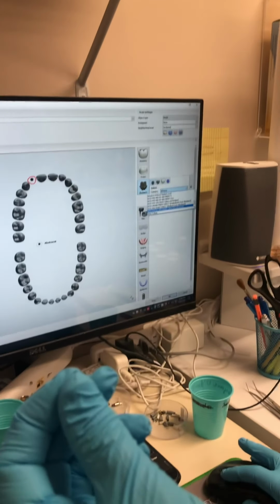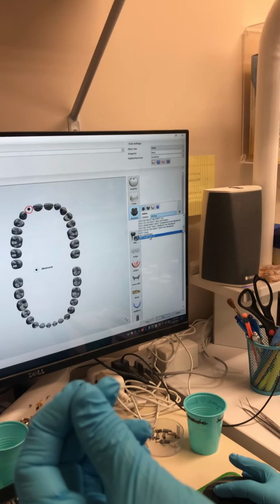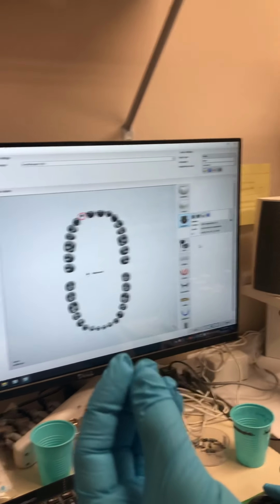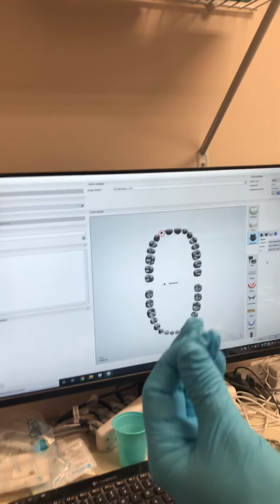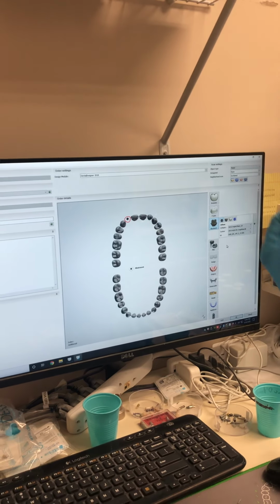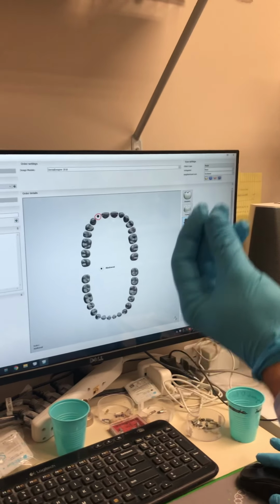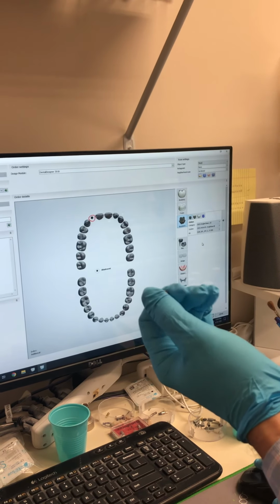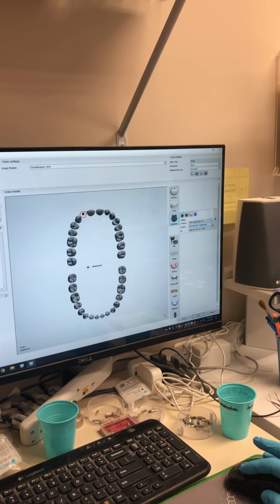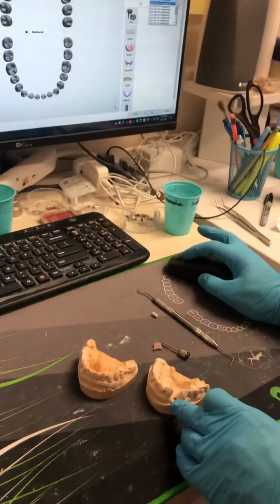DES, which is an angled abutment for US, click on it. All this information is given to you by the company. Any company, Nobel Biocare, DES, whoever, Straumann, they give you the library for free. All you have to do is download it in the program. They do it actually for you remotely if you ask them to. And after that, you have access to it. So is it DES Nobel? We have to, because the implant is Nobel, regular platform.